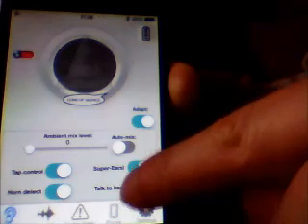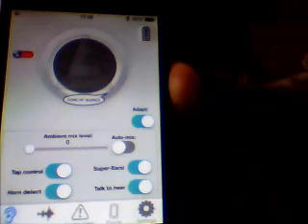And this here talk to hear switch sends a BTLE command to enable or disable an algorithm system running on the earphone hardware. When enabled, the talk to hear algorithm automatically detects when the earphone user is talking, and when detected, it mutes music playback and passes through ambient sound.